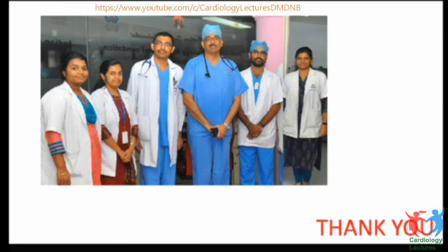But most probably you have to see whether it is compromising. If the lumen area is very big, with a little amount of tissue prolapse, you can just leave it alone. Suppose more than 50% of your stent is occupied by tissue prolapse, then you have to do something to remove that prolapse, particularly when it is necrotic material, because it's highly thrombogenic. That is why this irregular tissue prolapse is associated with more events. Okay, then you have to do something.